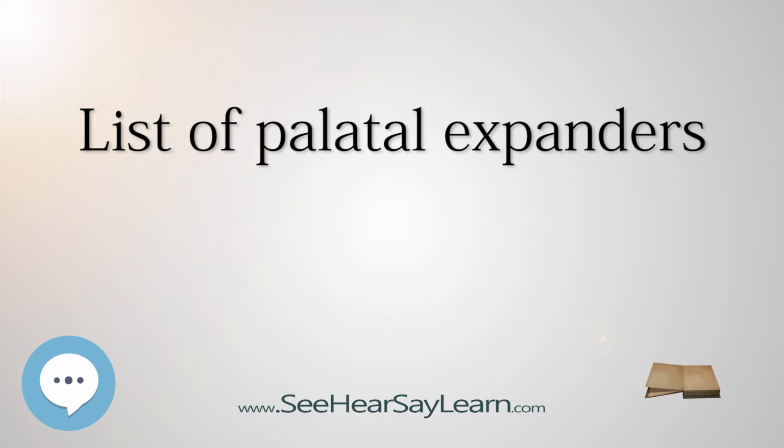However, a study published by Lagravère et al. in 2010 stated that there was no difference between the bone-borne and tooth-borne expansion devices. Both types of expanders showed similar results and the greatest changes were seen in the transverse dimension. Changes in the vertical and anteroposterior dimensions were negligible.